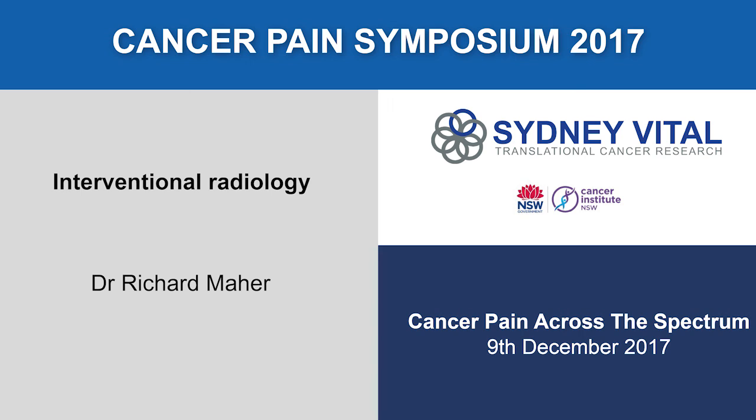And this is her 2.5 years later. Sadly, she has passed away recently, but she had capsular retraction, so that whole right lobe of the liver atrophied down, and she had compensatory hypertrophy of the left lobe of the liver. So that was just saying the combination therapies are very good as well. More and more we're using combination therapies. This is an example of someone who had an RF ablation followed by vertebroplasty.